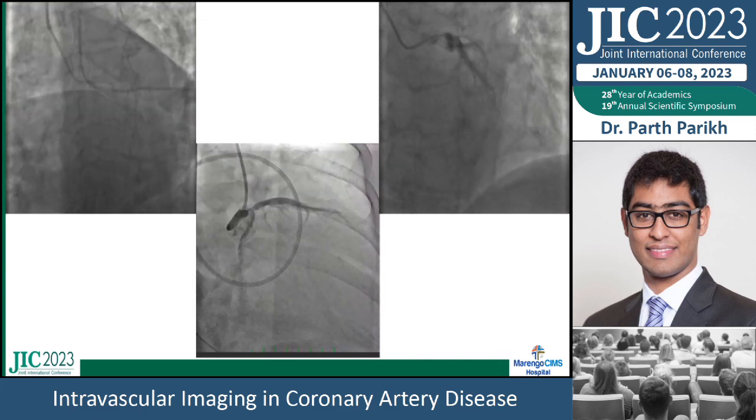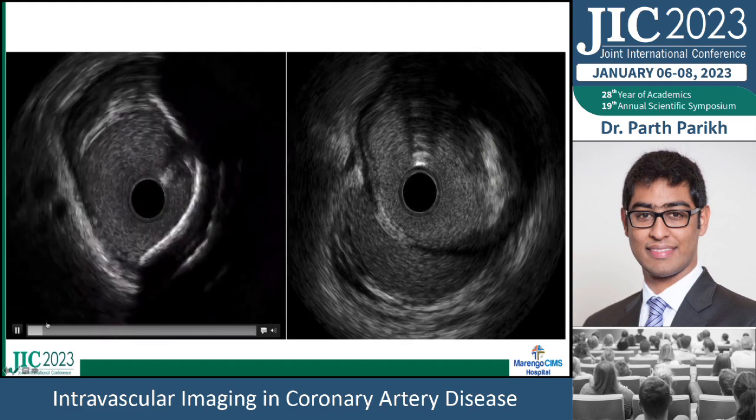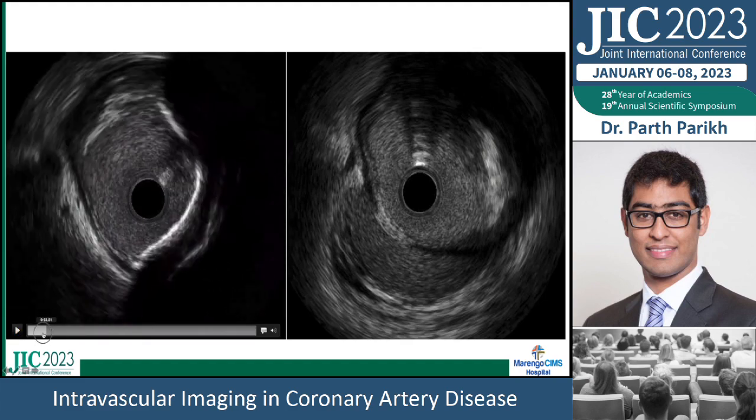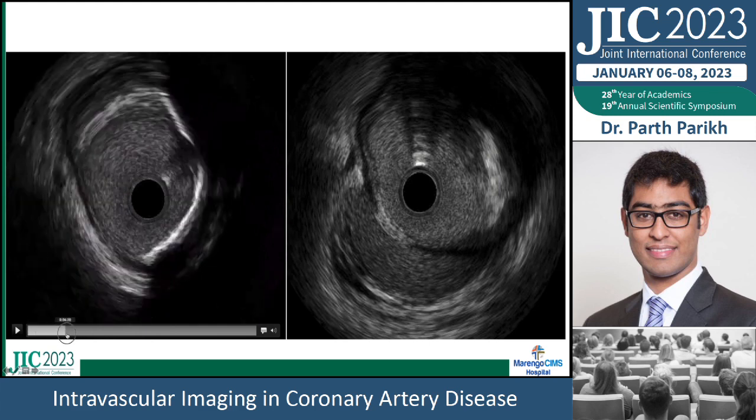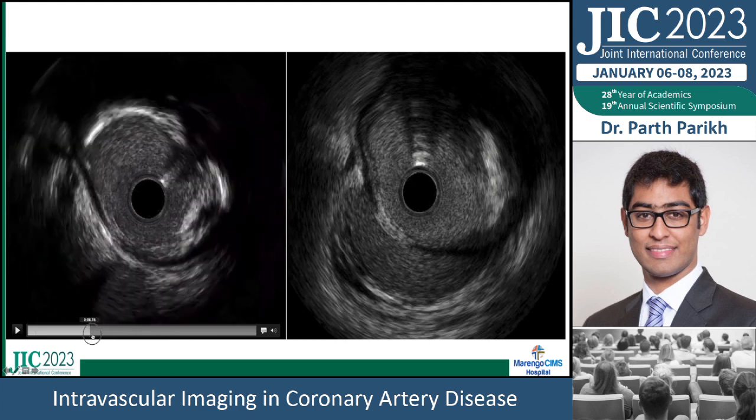and in this kind of a case, IVUS helps us to understand what we want to do with the lesion. Here, the white stuff is the calcium beyond which you cannot see. So there is calcification in the vessel, along with fibrous disease.